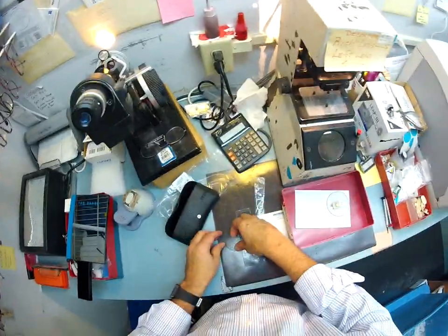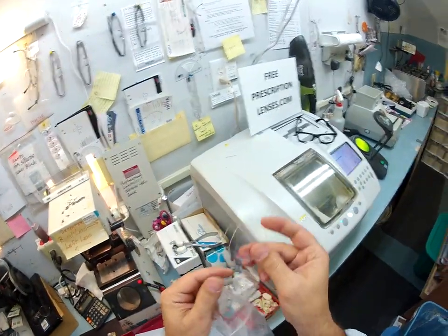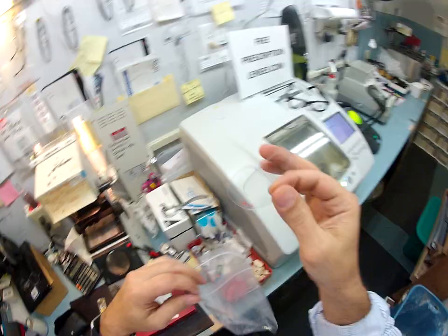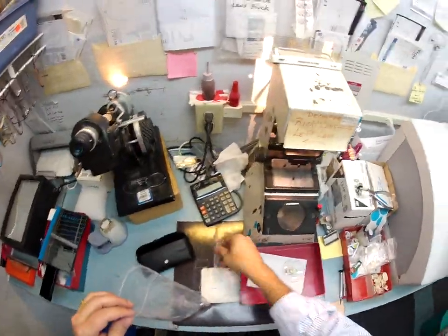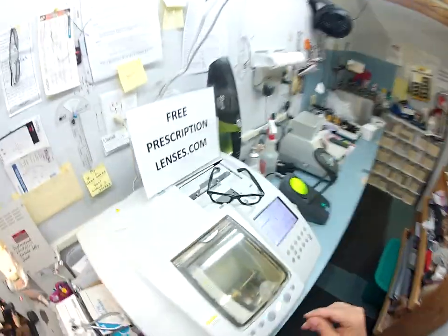Let me get all your stuff ready for shipping. These are your original demo lenses that came out of the frame — I include these because years from now if you ever want to sell your frame, you've got the original demo lenses to keep the value high. And of course I'm going to put the sleeve on there for shipping purposes.